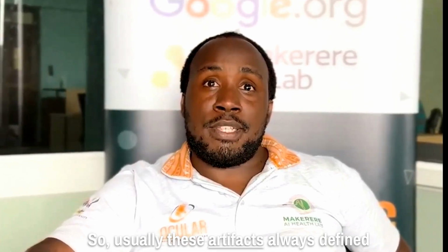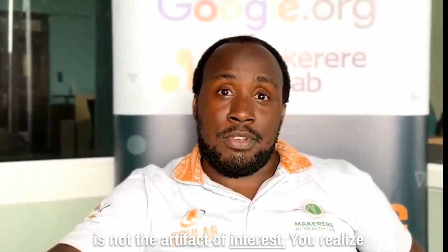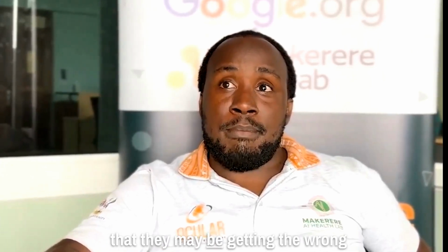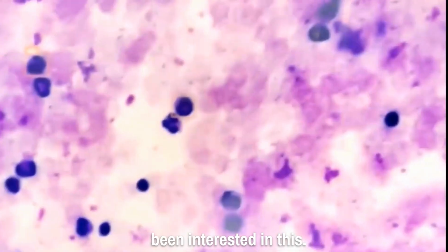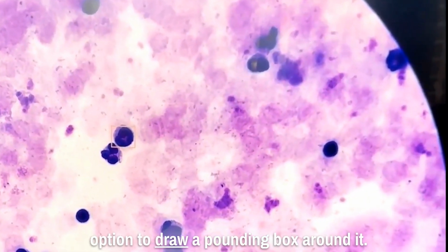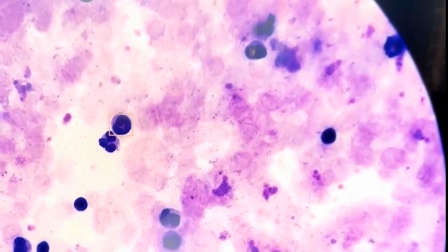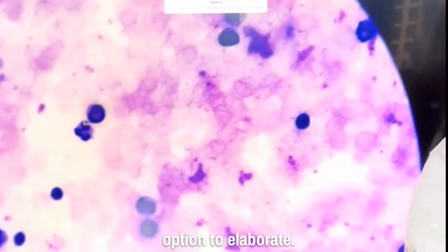Usually these artifacts are defined by their morphology. So if someone identifies something that is not the artifact of interest, they may be getting the wrong information, yet the lecturer meant something else. So instead of just pointing at it, I have an option to draw a bounding box around it, like this is the white blood cell, and I have an option to label it.